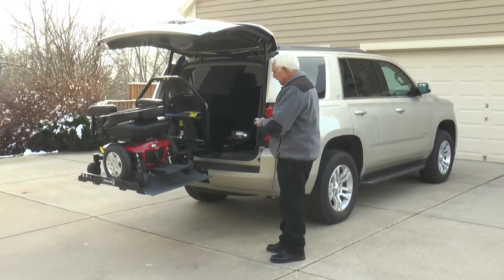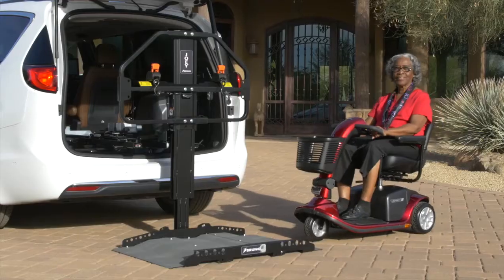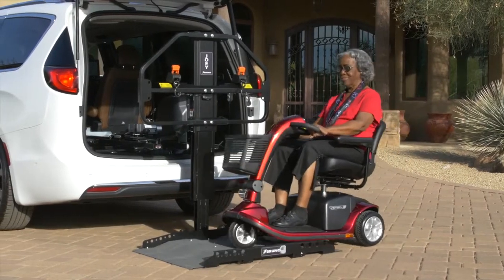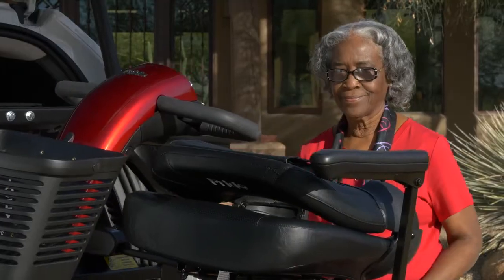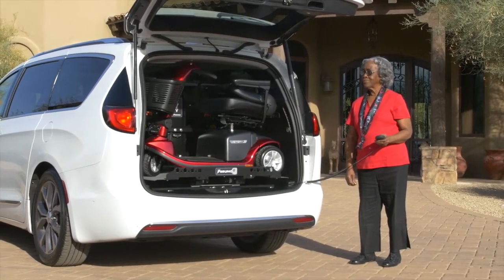Simply push the button and the fully powered lift lowers and self-levels. Ride a scooter or power chair onto the platform until the wheels catch in place. Push the button and the lift retracts into the cargo area and you're ready to go.